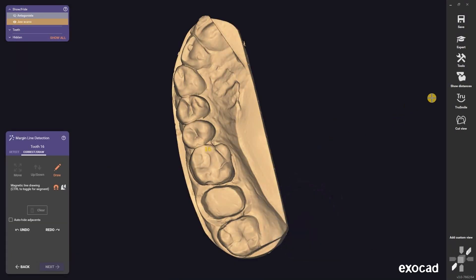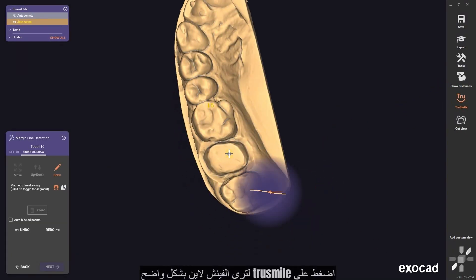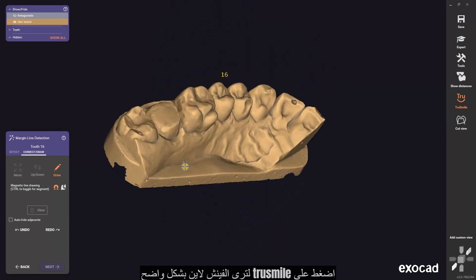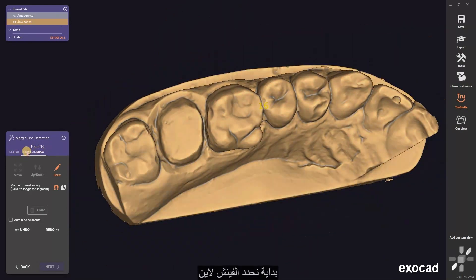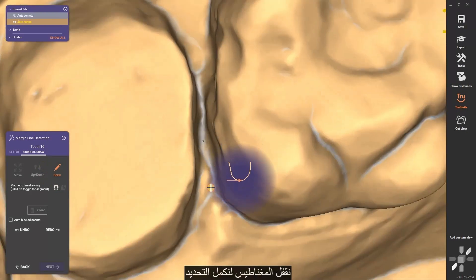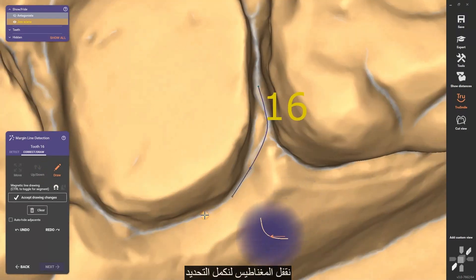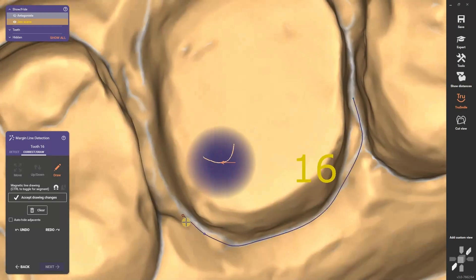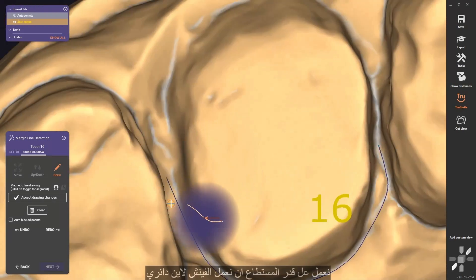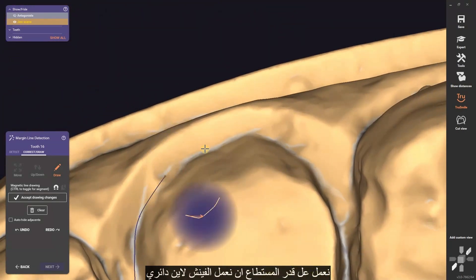Press on true smile to see the finish line more clearly. First of all, we will detect the margin line. Close the magnet and complete the selection. We work as much as possible to make a circular finish line.